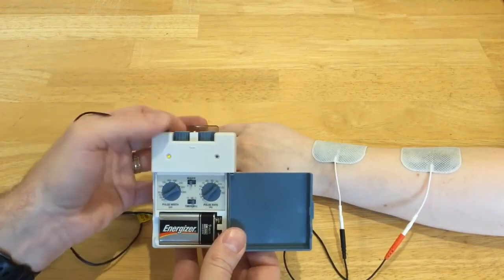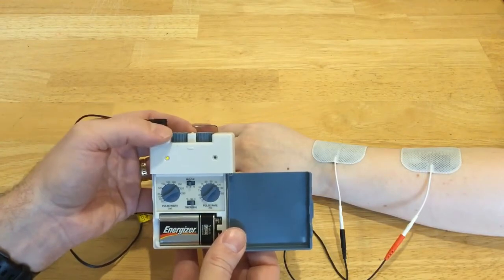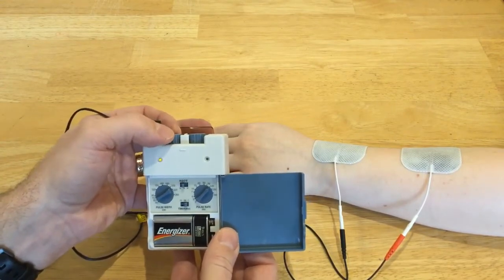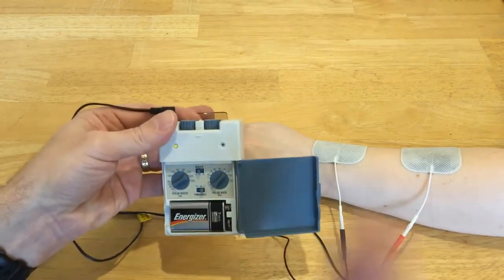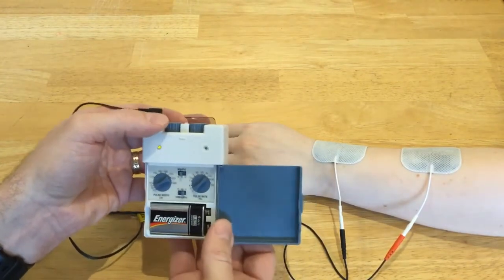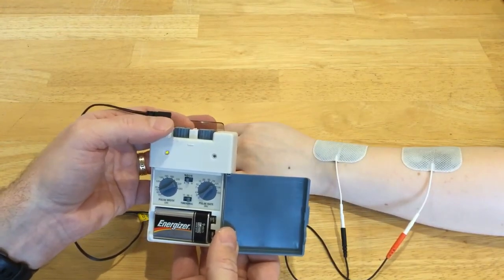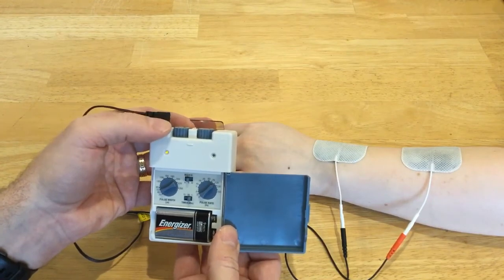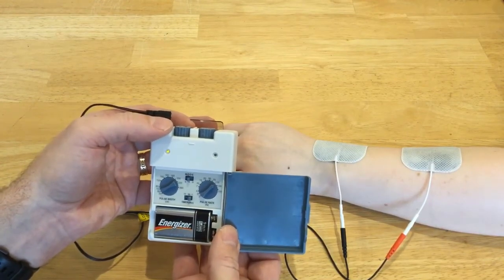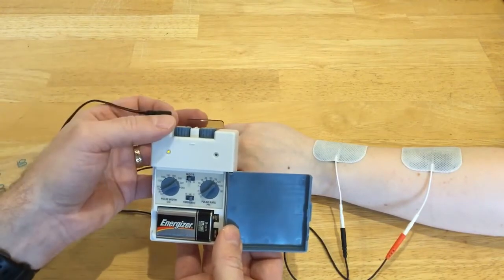You could leave this on as long as you wanted, up to really 24 hours a day. And the conventional TENS will close the gate on the pain signals. Conventional TENS also seems to do some endorphin release as well, but primarily we think of it anyway as closing the gate. And you could turn it up a little higher to get a little more intense tingling, and that would be fine.